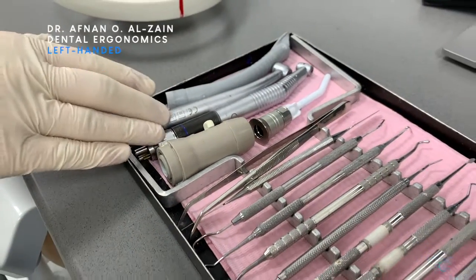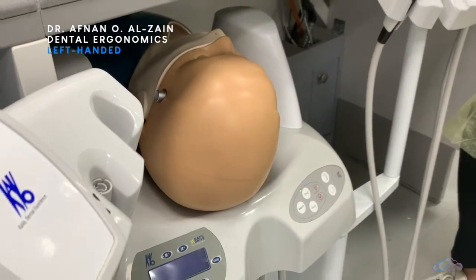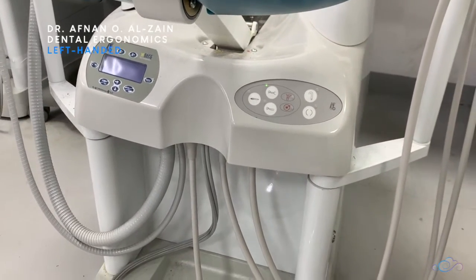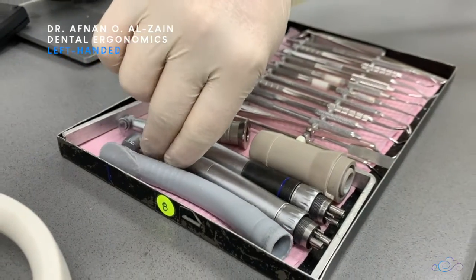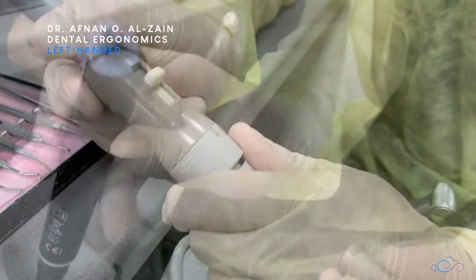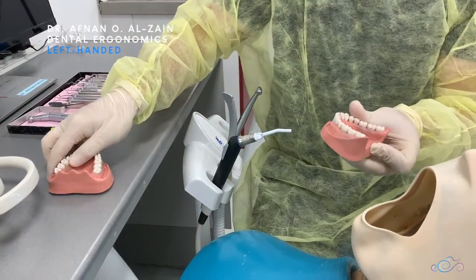After that you're going to make sure your instrument tray is complete. After that you're going to move the dummy head and prepare your position. Then you're going to install the handpieces, the high volume suction, and three-way syringe. After that you're going to install the upper and lower jaws in the phantom head.